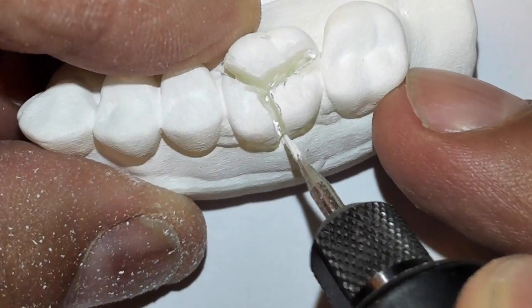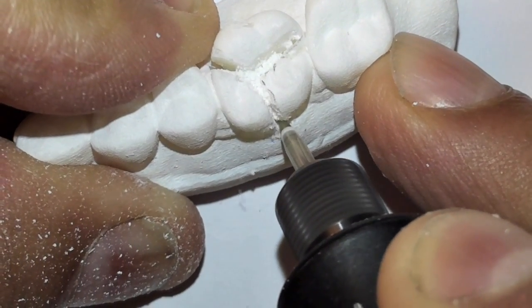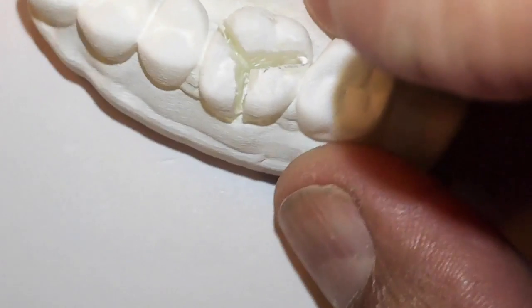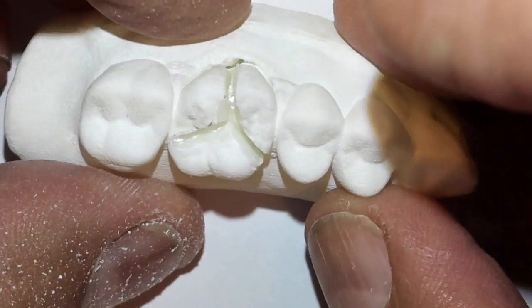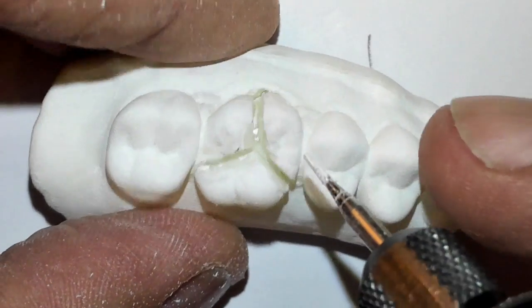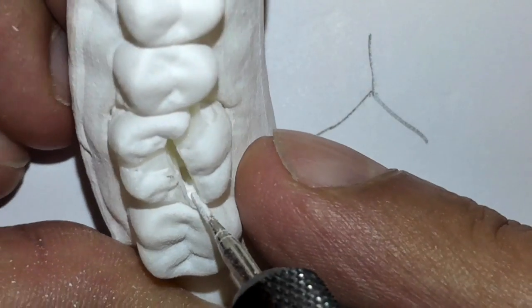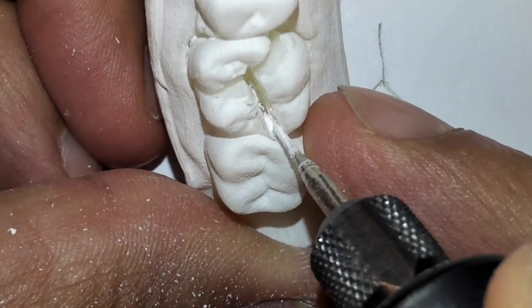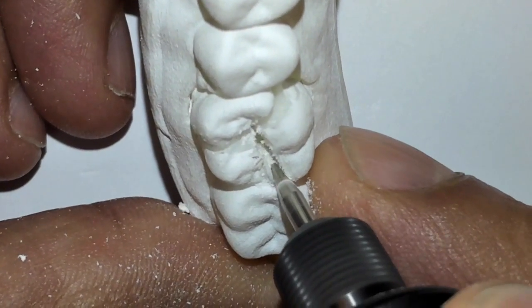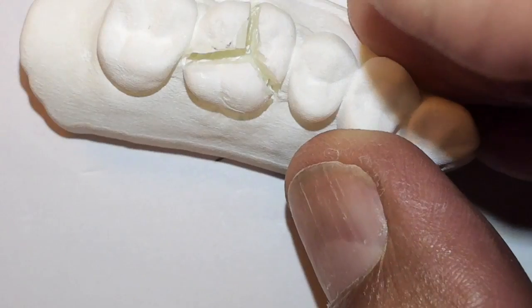Come down the buccal. Now you're going to try not to destroy the model outside of the tooth — that's important. Certainly a difference from that of the model with the typodont tooth in there. We were doing stone models, comparing now printed models with stone. It's just an exercise in determining the methodology of removing a tooth atraumatically. Now I'm going to go ahead and see if I can separate it a little more on the distal aspect — get all the way through without nicking the adjacent tooth. That's the key.